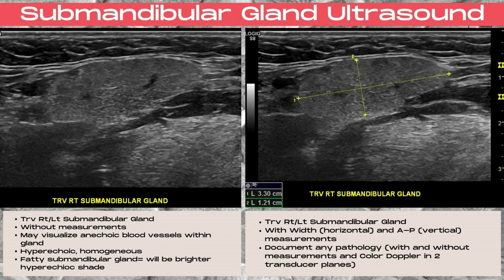Now let's look at some ultrasound images of the submandibular glands. For the transverse submandibular gland, you want to document without and with width and AP measurements — these are a horizontal and a vertical measurement on the ultrasound. The gland is going to appear hyperechoic with a homogenous signal, and will be brighter and more hyperechoic depending on how much fat is within the glands.